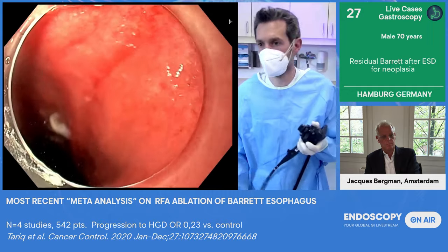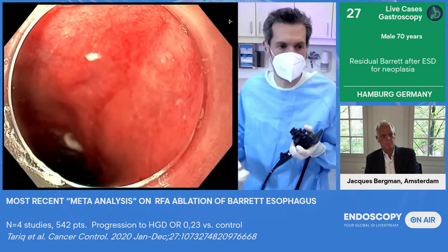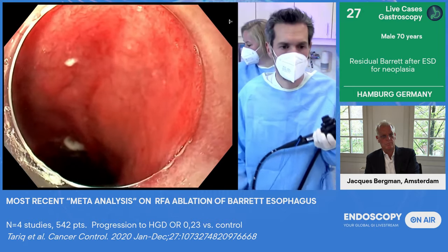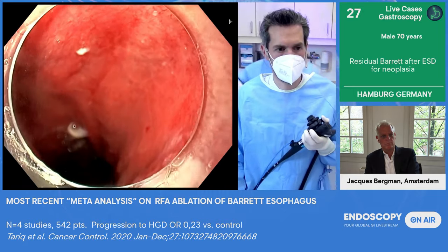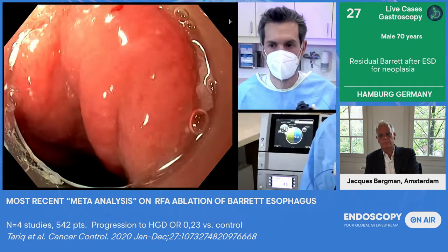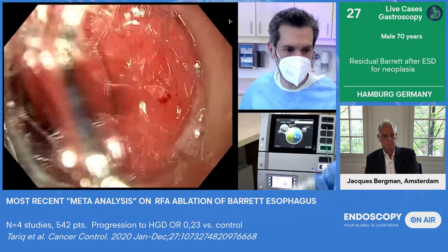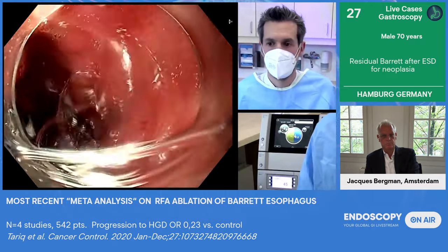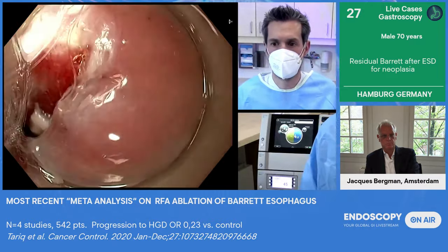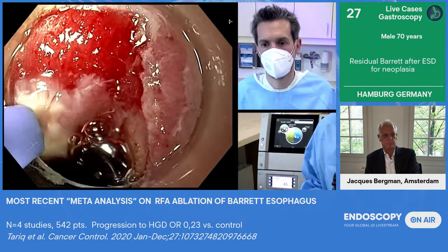Okay, now we have to change the settings on the VIO 3 from pulsed APC with an effect of 6. Maybe you can see the VIO 3 as well. Okay, yeah, there you see. So this is the pulsed APC with the effect of 4. And we are doing a second round of ablation in this area with a lower effect.